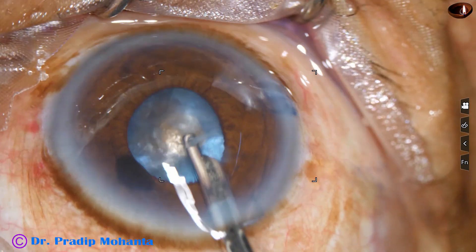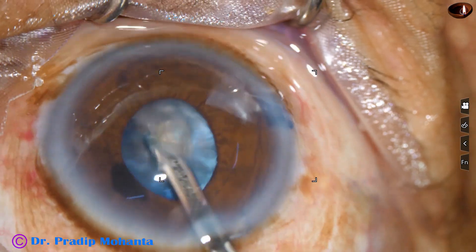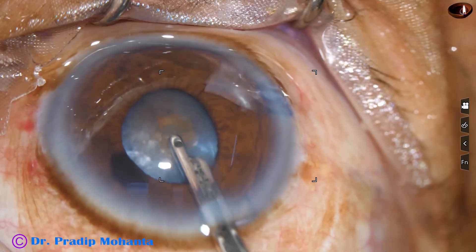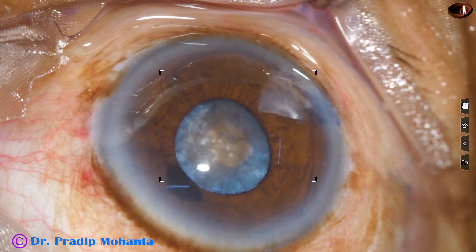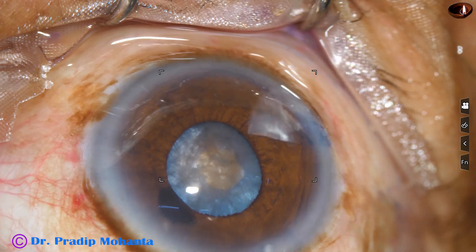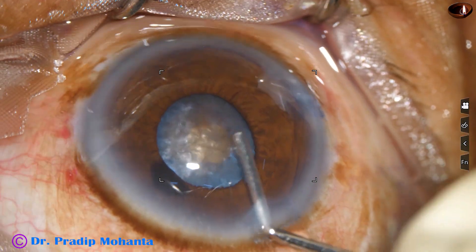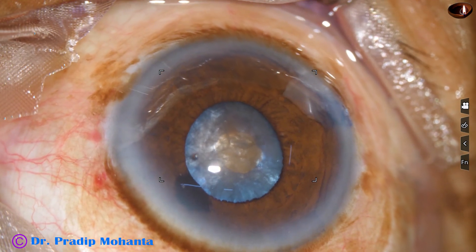Now the cortical matter is coming from the equator, from the posterior aspect, anteriorly. In this process, hydrodissection is already done, so we don't have to do hydrodissection after enlarging the small rhexis.